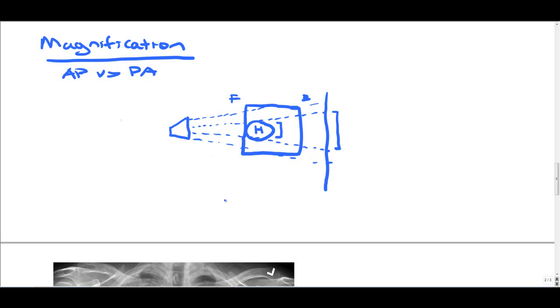So in this case, the heart is close to the front, so when the waves hit it, there's magnification when it hits the detector on the back. So actually, the film that you get in AP view, the heart is actually slightly larger than the actual size of the chest.